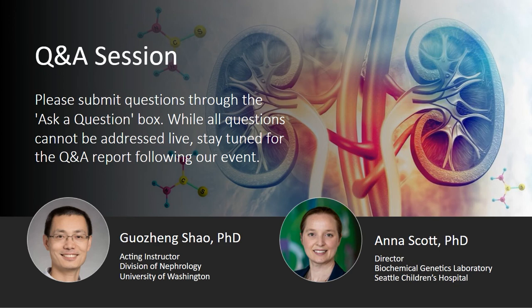Yeah, I would like to know what chemical species other than amino acids are characterized in your lab. Ooh, so beyond amino acids, I think one of our other highest volume tests with pretty high accuracy and precision is measurement of acyl carnitines. So these are medium and short chain free fatty acids that are conjugated to a carnitine molecule for transport in and out of cells, primarily heading to the mitochondria for ATP production. I'd say from a quantitation standpoint, that's our other big test.